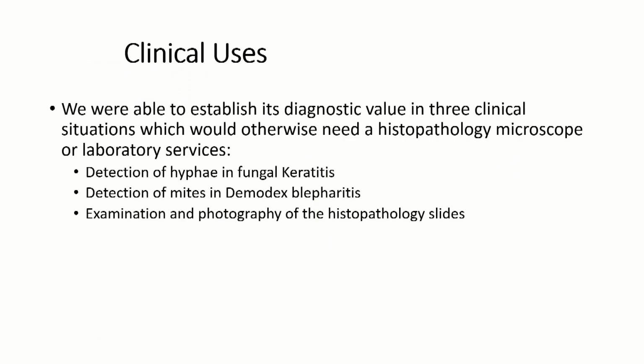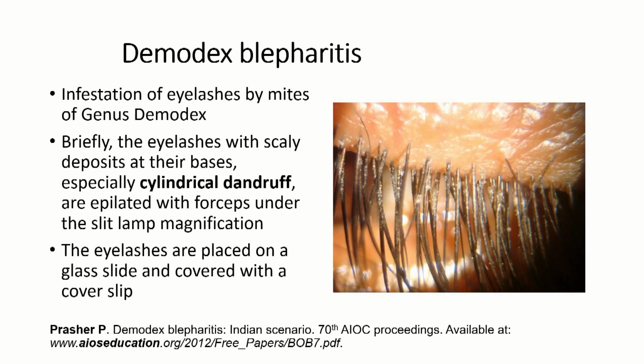So we were able to establish its diagnostic value in 3 clinical situations which would otherwise need a histopathology microscope or laboratory services. The first is Demodex blepharitis, which is infestation of eyelashes by mites of genus Demodex, and it is characterized classically by deposits at the base of eyelashes known as cylindrical dandruff. To make this diagnosis, the eyelashes are epilated with forceps, placed on the glass slide, covered with a cover slip and examined under the microscope.